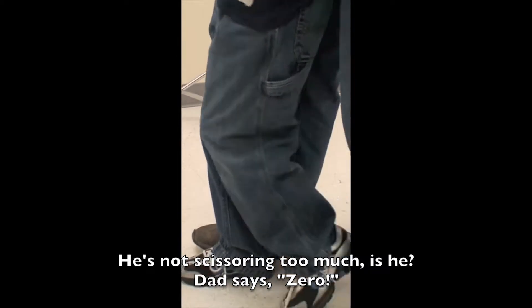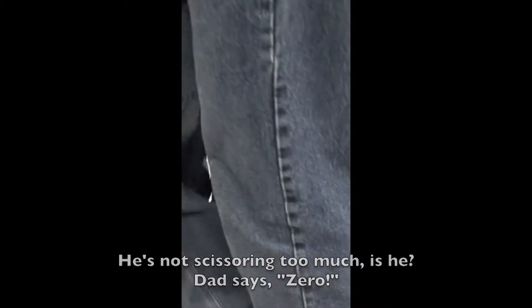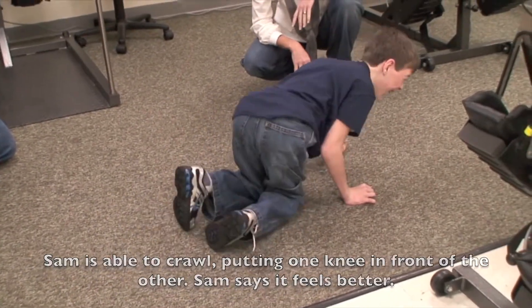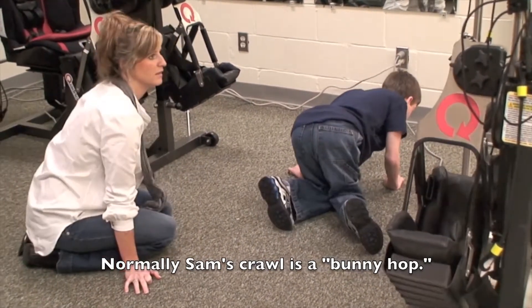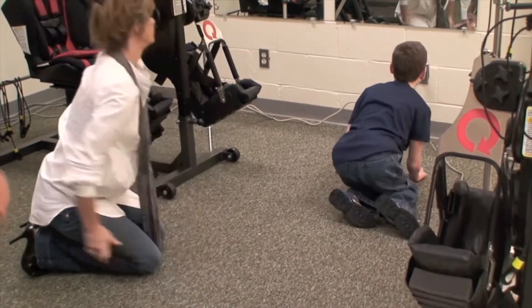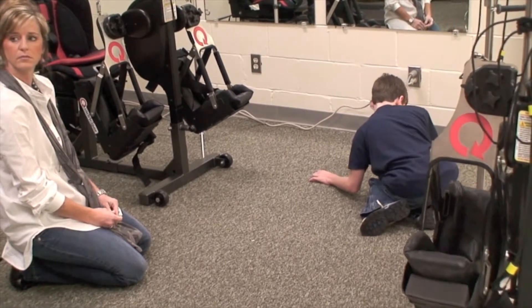Normally when I say scissoring, he's like this — and then this step is hard because this foot's dragging to cross. His crawl is a bunny hop — he would sit on his bottom and just hop. They say the most thing similar to walking is a reciprocating crawl where your left hand and right knee, right hand and left knee move together. When you do that, little infants stand up and walk after that.